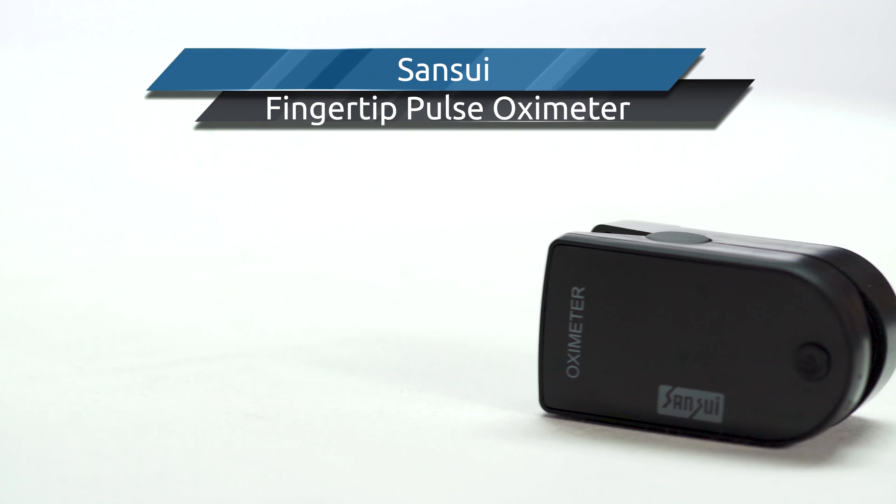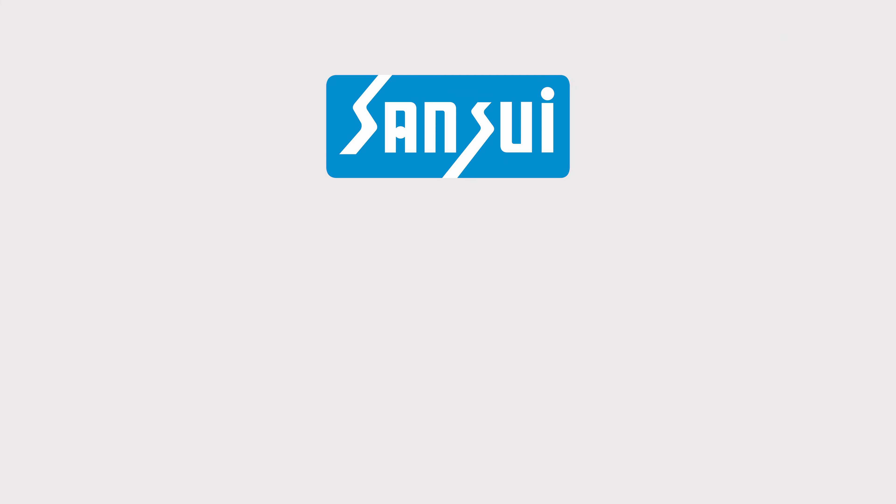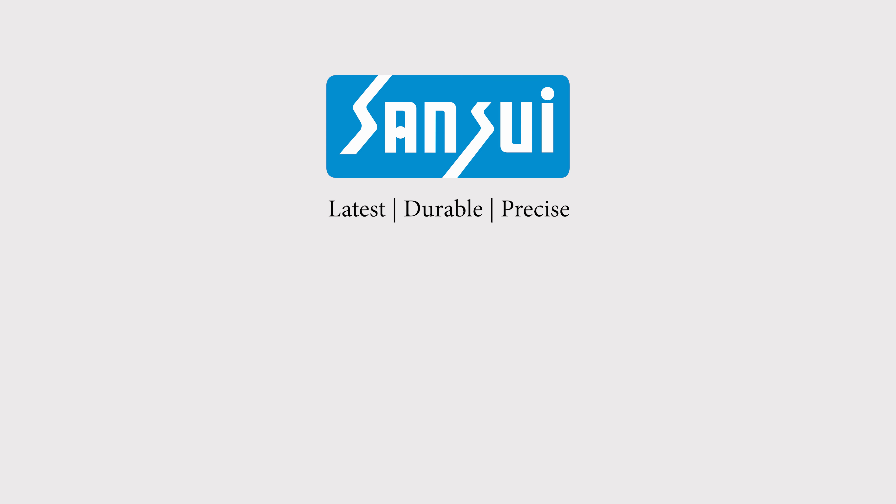Stay safe. Stay healthy. Sansui — Latest. Durable. Precise. A brand of latest technology, more durability, and high precision.